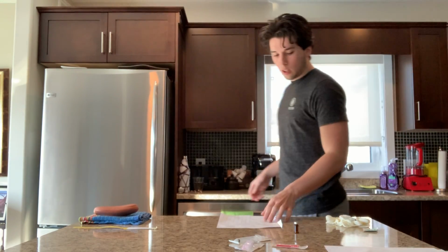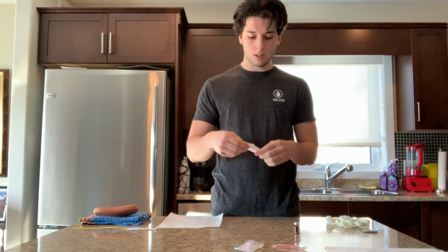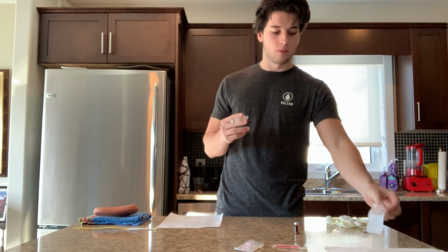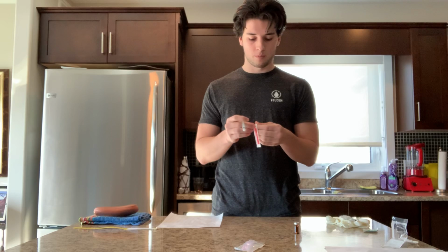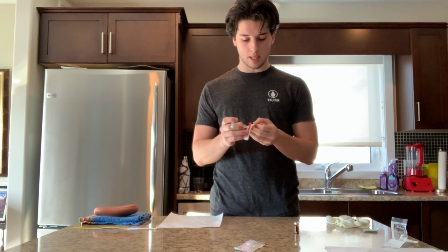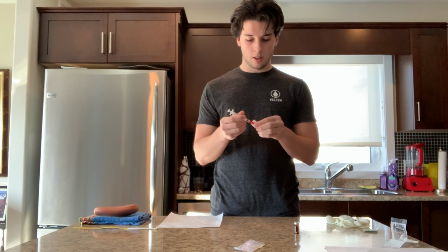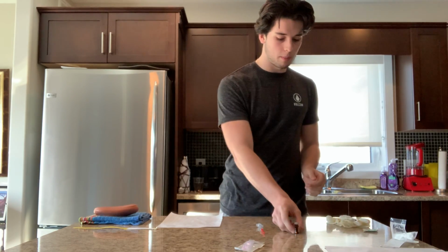So now that we have all of our supplies that we're going to need for the procedure, I can start off by grabbing my syringe, opening this, and grabbing my syringe. And now that I have my syringe, I can grab my blunt fill needle, and I'm going to attach the two. All right, now that the two are attached, I can set this down right now. I can throw that away and I will grab my medication vial.